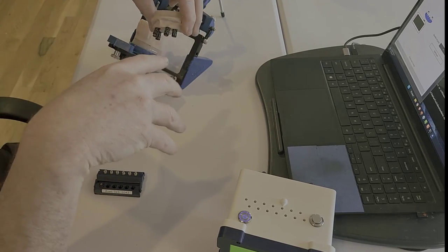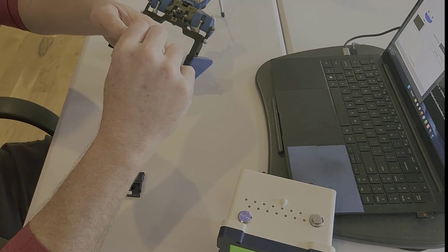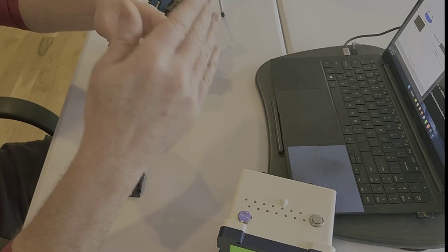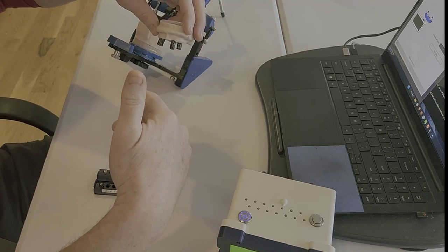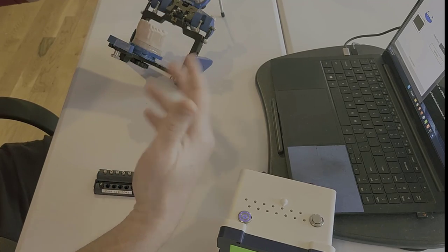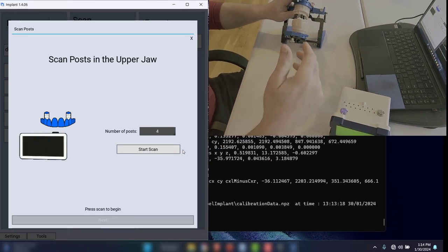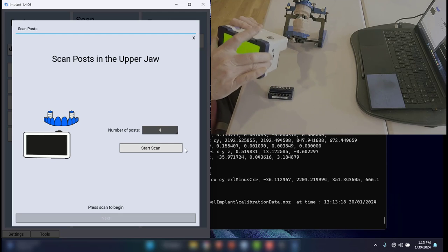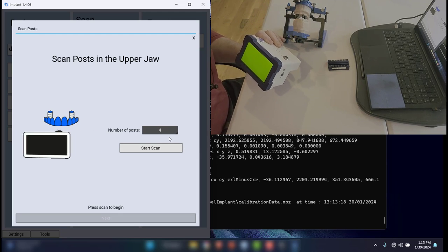Okay, so the reason for that is if you had two sets of posts and you put in the upper and the lower posts, then while you're scanning the upper, it's only going to pick up ones that are oriented facing down like this, like a maxilla. And if you indicate mandible, the same thing. So it's not going to errantly pick up the wrong arches of posts. All right, so just a really simple thing that I was unaware of until I did that.